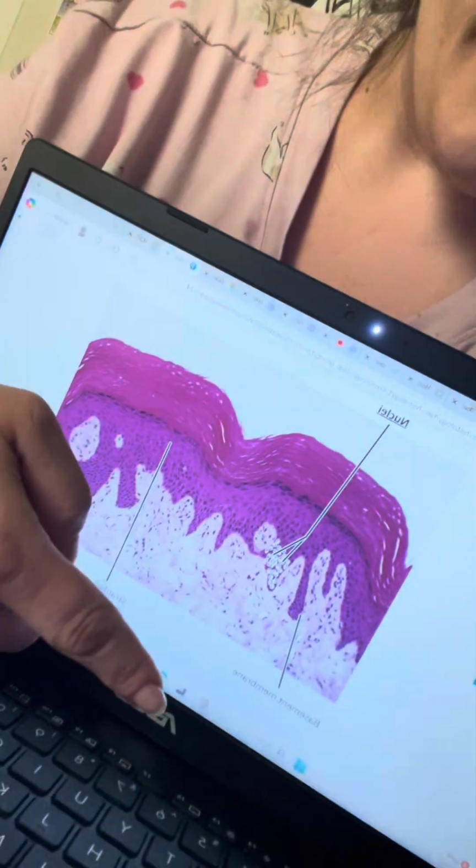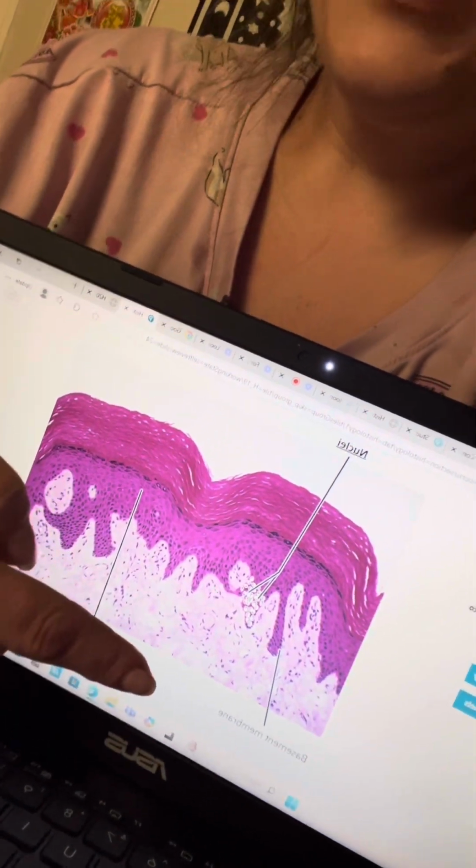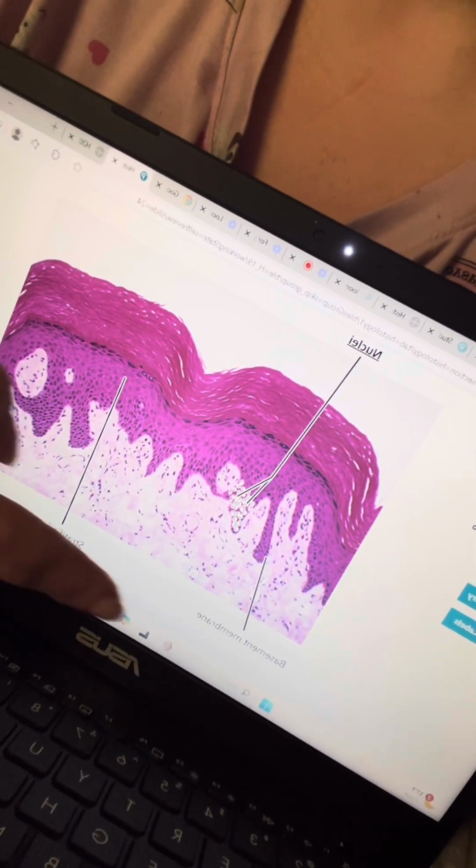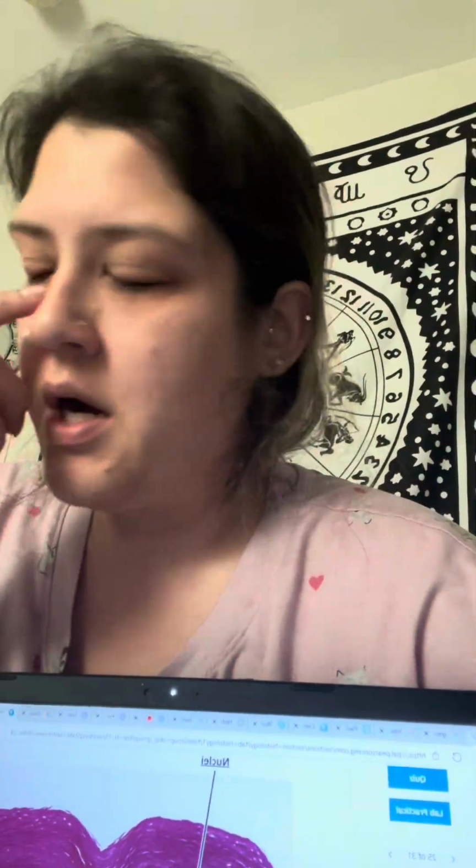It's not labeled, but we know that below that there is connective tissue that supports and binds, and it's filled with cells, fibers, ground substance, and an extracellular matrix. So there's a lot of fascinating stuff going on down there. Also, to note, besides the epidermis, the rest of the layers below are vascular. The epidermis is avascular. These layers are vascular and innervated, and in the connective tissue is where we'll find the nerves and the blood supply and whatnot. So it's very fascinating.